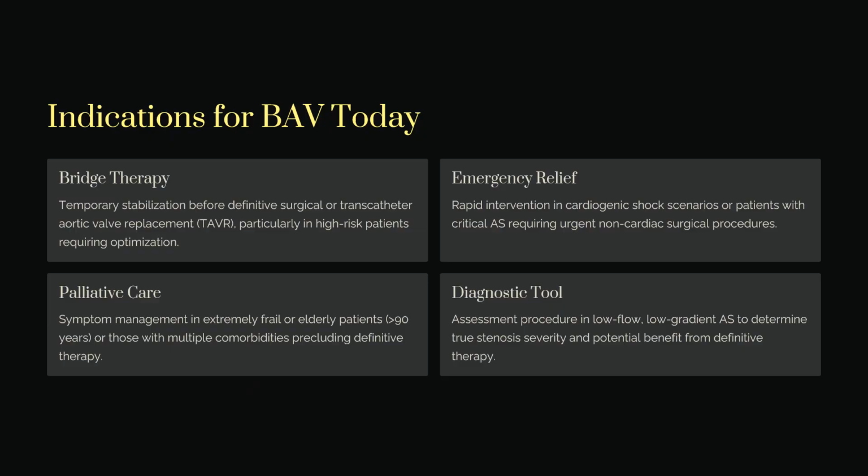Indications of BAV today. Bridge therapy. Temporary stabilization before definitive surgical or transcatheter aortic valve replacement. So before the valve replacement, this can be a bridge therapy, particularly in high-risk patients requiring optimization.